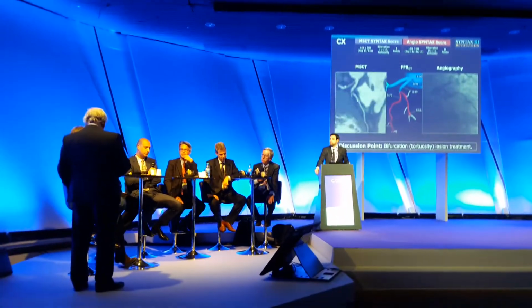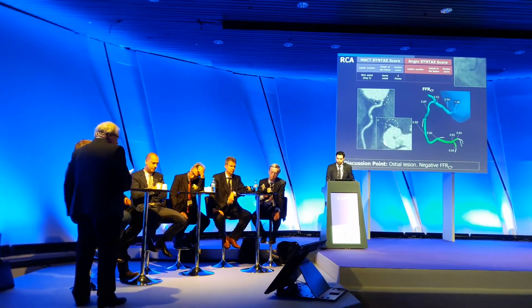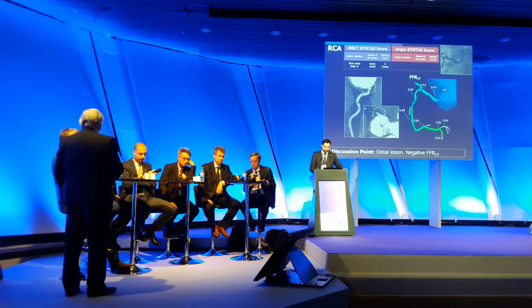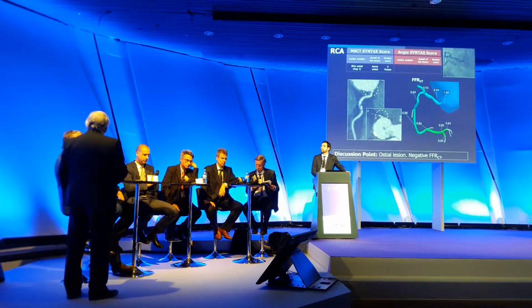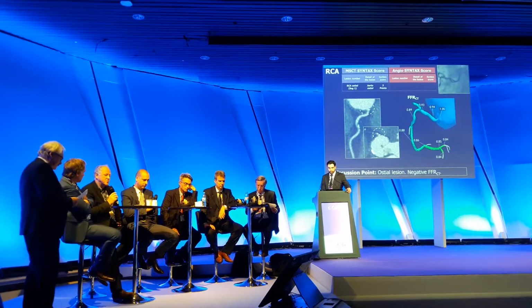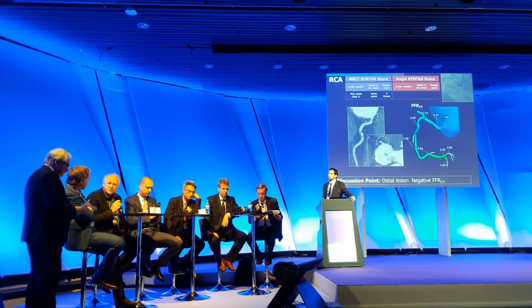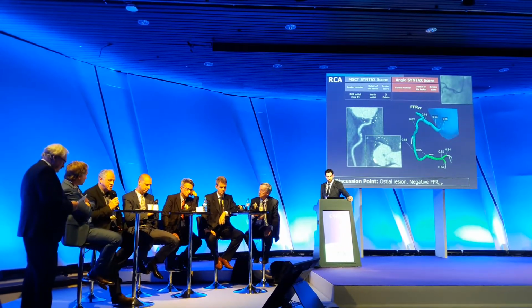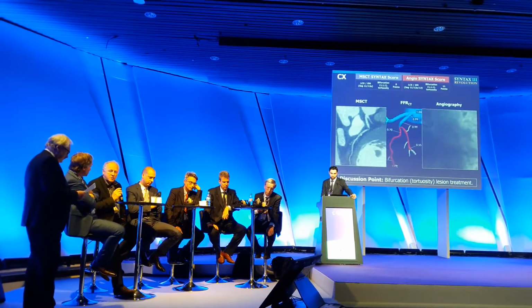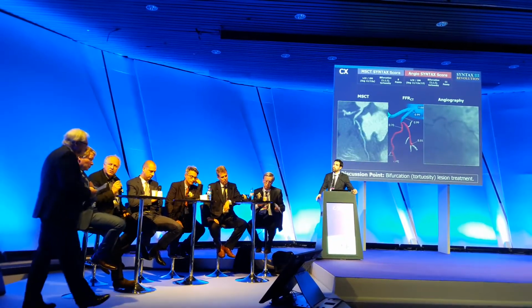Very good. So, Johan Lemay, you are the radiologist. In the meantime, you have discovered the multi-slice CT scan and the FFR-CT. Is there anything that you would advise differently in the heart team, or do you have the same opinion? So I agree. The FFR-CT confirms what we suspected on the angio. The RCA has no significant disease, in my opinion. And on the other hand, CT and FFR-CT also confirm the long lesions in the LAD and the severe bifurcation lesion on the CX and the OM. So, in conclusion, I completely agree with my colleagues.